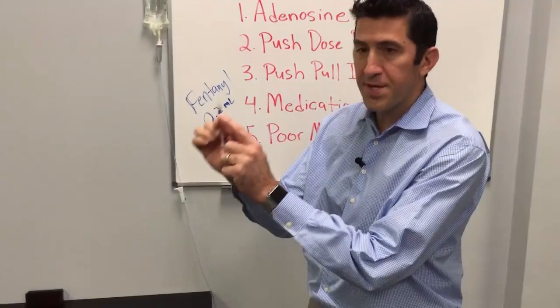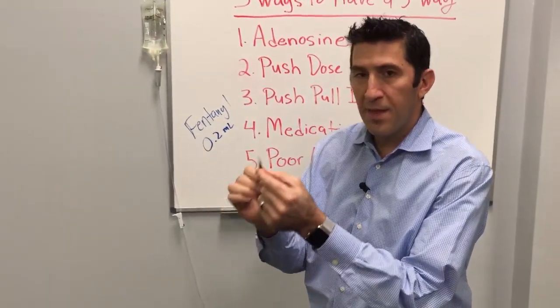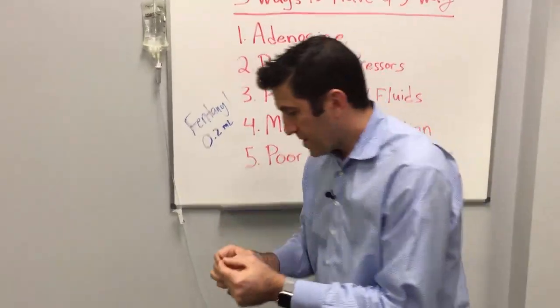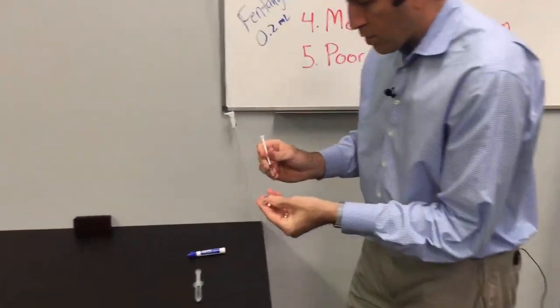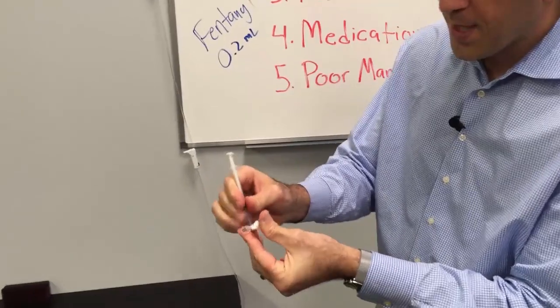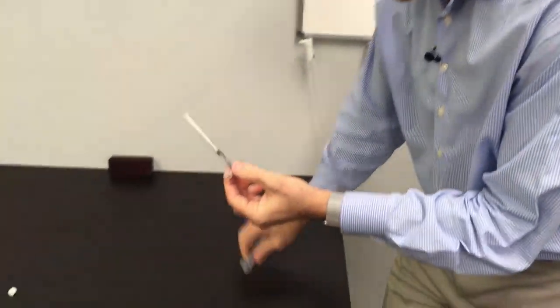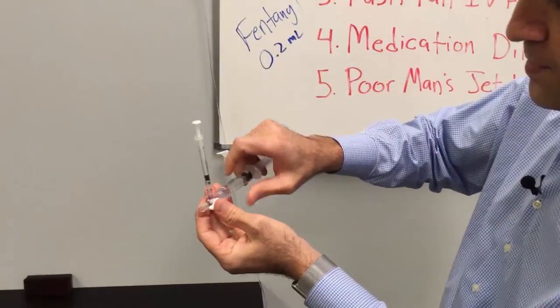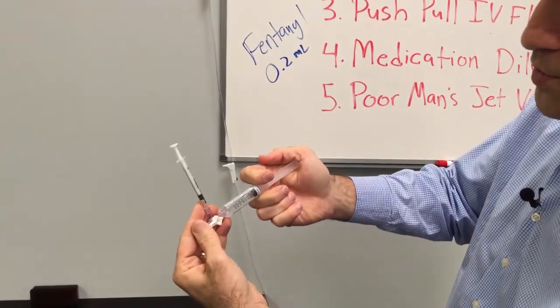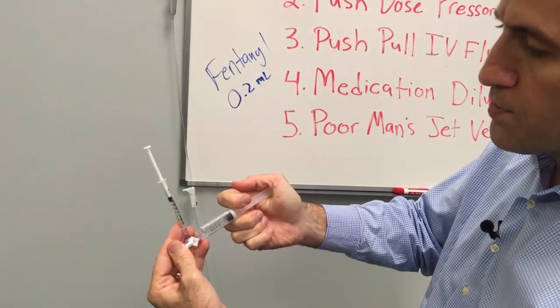So here's my fentanyl, I've drawn up 0.2 ml, but getting that through an IV may not be the best idea. So what we'll do is, we'll go ahead and put it onto the three-way stopcock. We'll go off here, we'll take a saline flush, and then simply we're just going to add some more volume to that syringe.